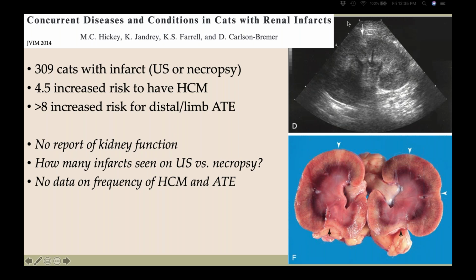Our cardiologists are a little bit dismissive of this paper because they feel like there were no card-carrying cardiologists involved with it and making the distinction. And certainly when you're making that call of hypertrophy, it is a very grey area when you're looking for just very small changes in thickness. Yeah, that's a really good point, Henny.